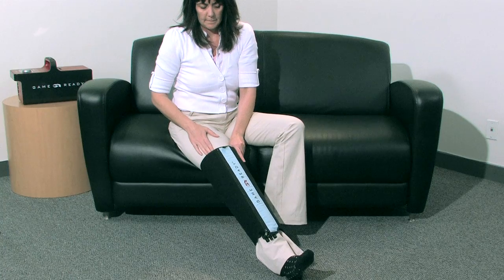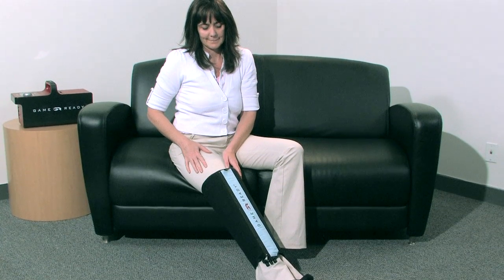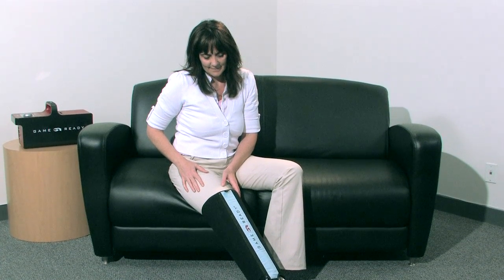Always apply the wrap snugly against the body with no wrinkles or creases, allowing water to travel throughout the entire wrap.